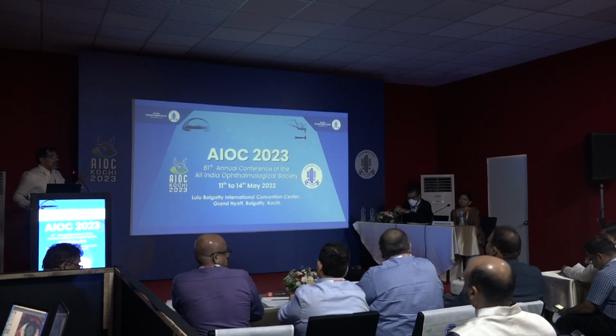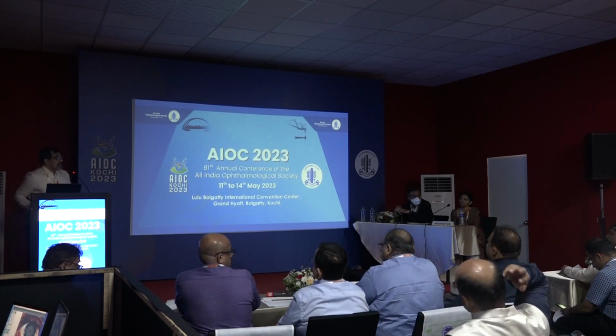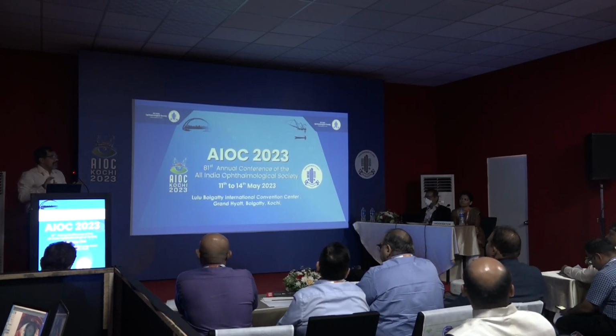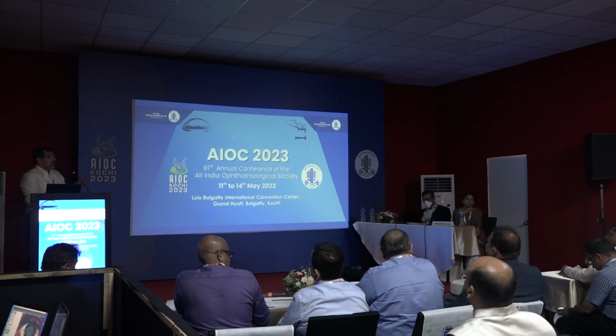If we get P1 and P2, then the difference between P1 and P2 will give us the true K. And the net astigmatism we get directly from the Barrett. It is directly accessing the Barrett. We need not fill in anything or go to the chart. Just press the button. It will tell you this is your K1, K2, anterior surface, and P2. This net astigmatism from Barrett will be this one.